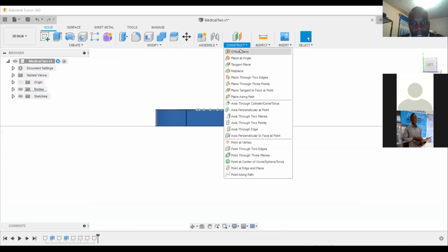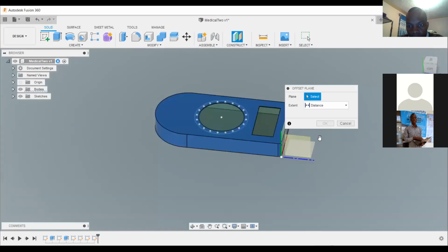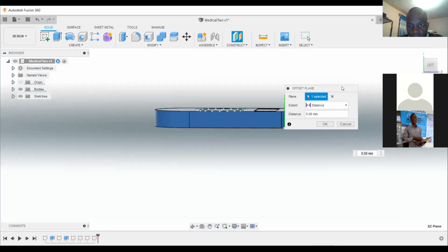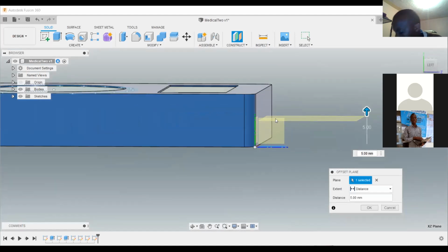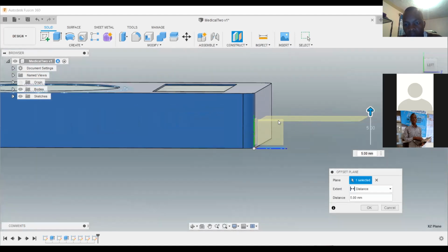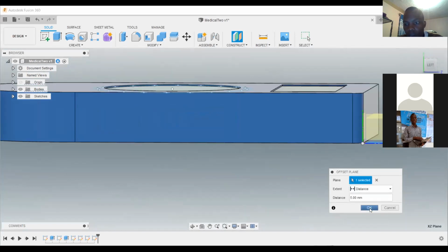So you come to construct, offset plane, construct, then offset plane. Then you should rotate it like that so that you see the bottom plane. Now your bottom plane is what we want to offset by 5 millimeters. So 5 millimeters, it will be almost itakuwa katikati, because remember this thing was 10. Okay, those who are not there yesterday, pay special attention because we are learning how to split. Okay, then you click okay.